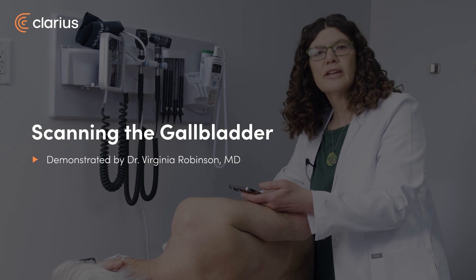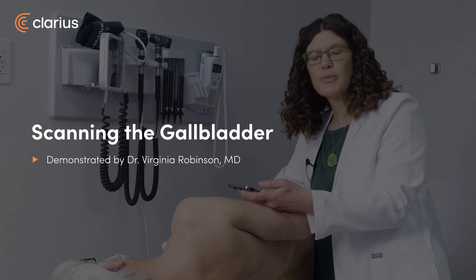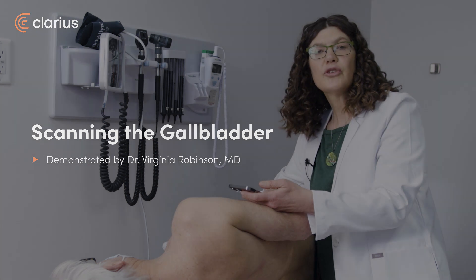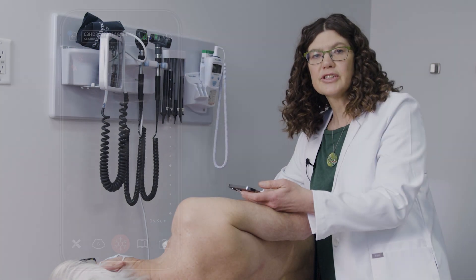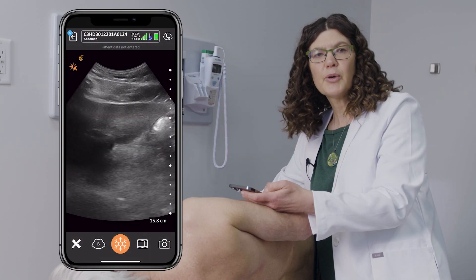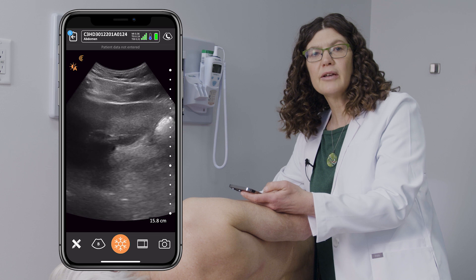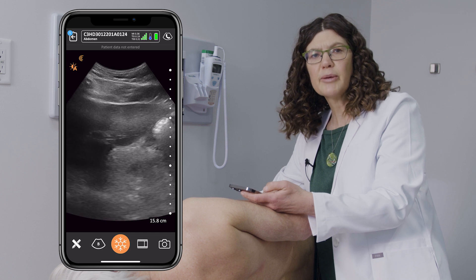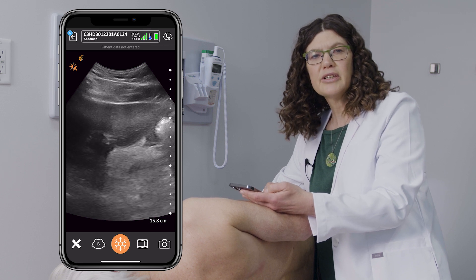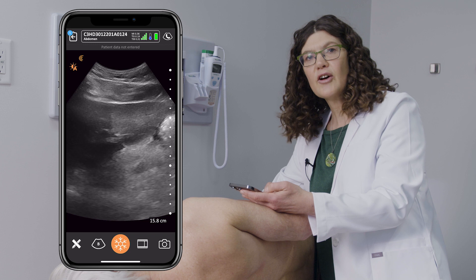Hi, I'm Virginia Robinson and I'm a full-service family doctor in Fernie, BC. Today we're going to review the gallbladder ultrasound, which can be very helpful for people experiencing right upper quadrant pain or just general abdominal pain, and can be diagnosed both in the office and at the hospital.